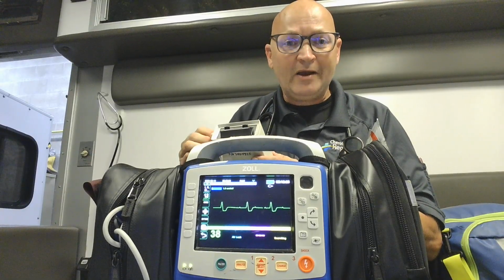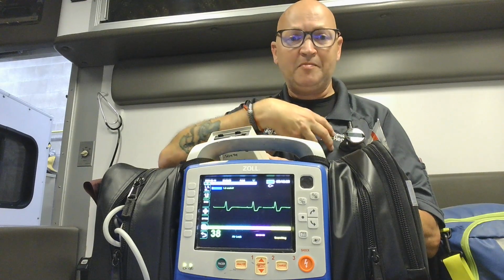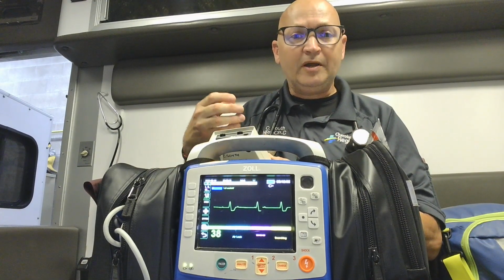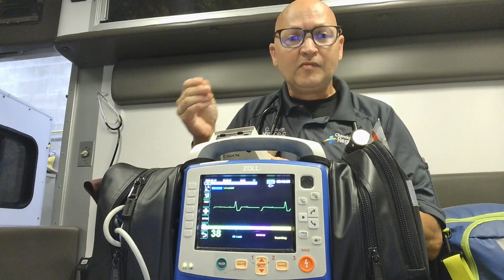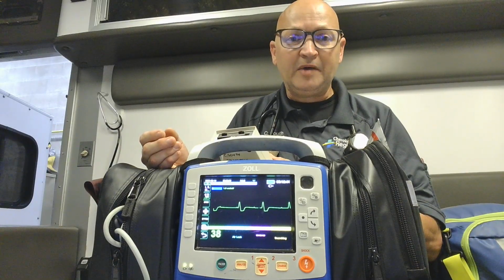These patients will require pacing. We put big patches on their chest and provide a tiny electrical jolt that takes over the pacemaking duties. This is called external pacing.